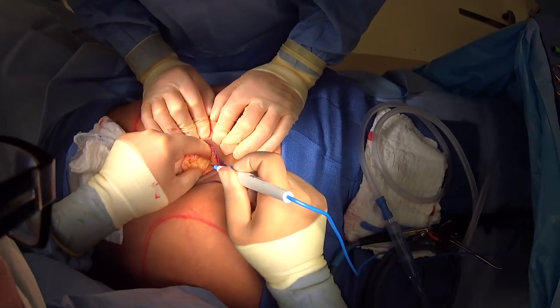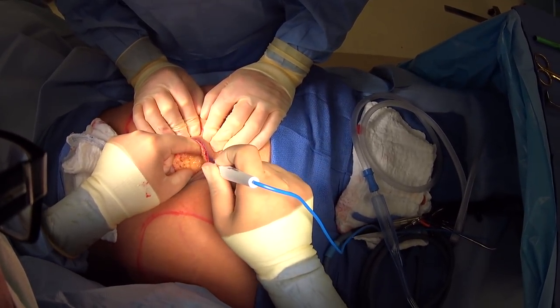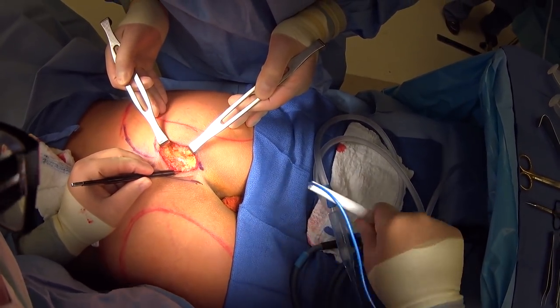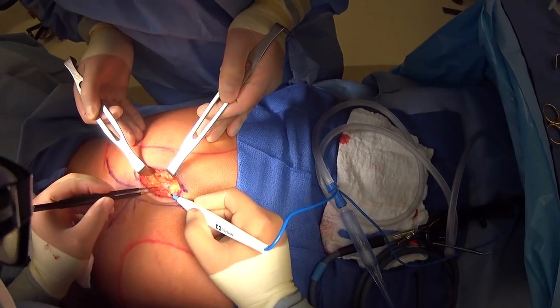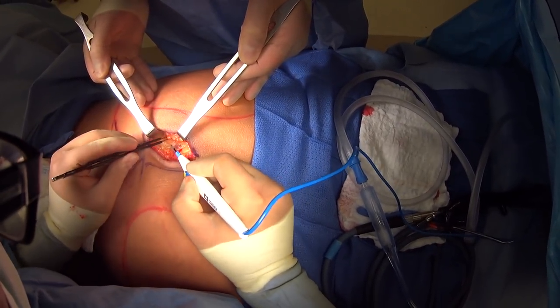You can see that superficial fascia, which we'll put back together when we close everything. Here you can see this white glimmer, which is actually her fascia — that's the strong covering over the muscle. So we'll open that fascia, and there you see her gluteus maximus muscle.